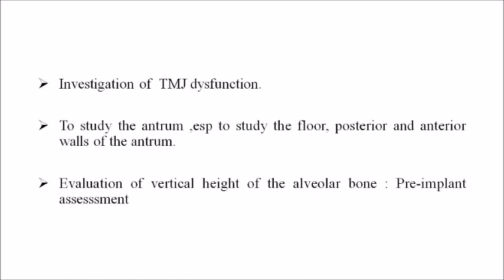The panoramic radiograph can also be used as an investigation of TMJ dysfunction, TMJ displacement, condyle fractures, coronoid fractures. It is an initial diagnostic method used to study the maxillary antrum and the floor, posterior, anterior, and lateral walls of the antrum, and for sinusitis. It can also be used to assess the vertical height of the alveolar bone for pre-implant assessment.